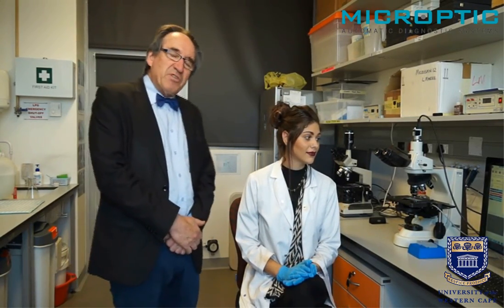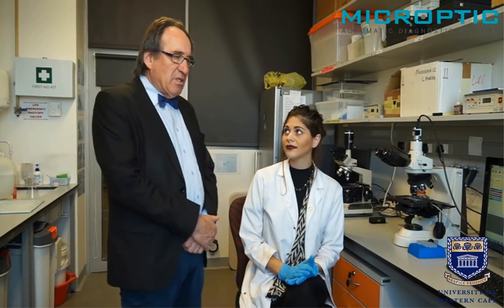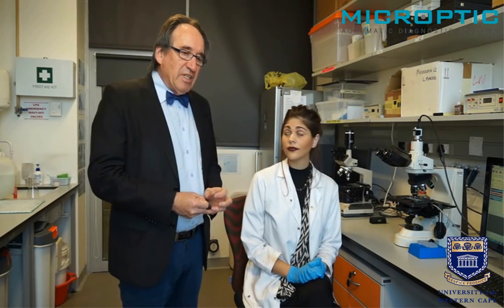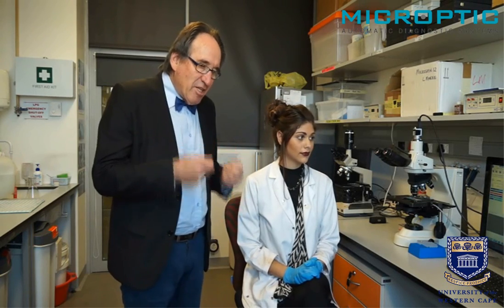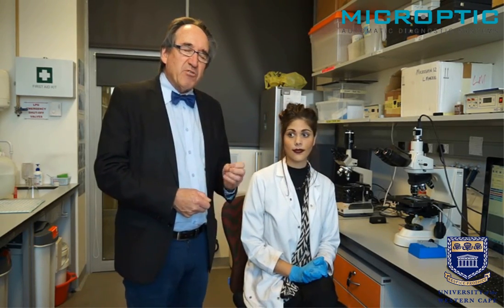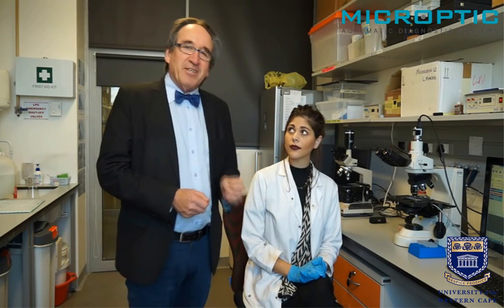Yes, it's very fast. And if the sperm concentration is very low, one can capture three or four more fields, but it is generally quite a fast procedure. What is more important is that it provides not only motility characteristics of sperm in semen, but by using these cutoff points, it provides extremely valuable information as to the ability to penetrate the cervical mucus.